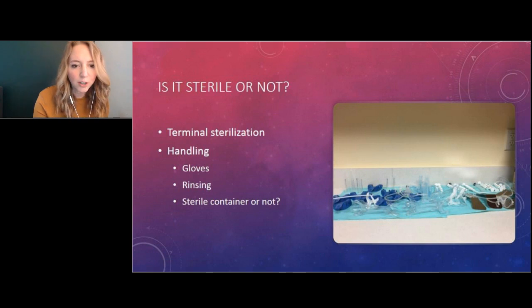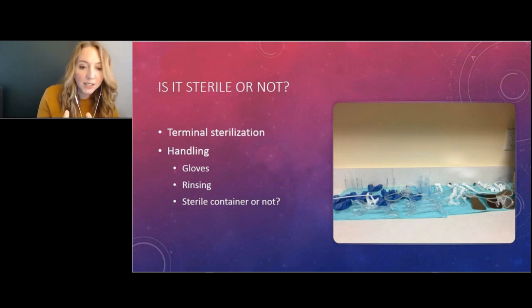I'm not sure if they're referring to actual room as in environmental cleaning, but let's stick to the topic of instrument reprocessing. What do you recommend for dental offices for sterilization? Is it cold chemical sterilization, high-level disinfection? Is it high temperature sterilization, et cetera?